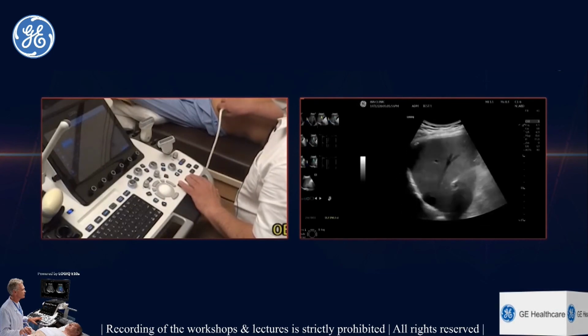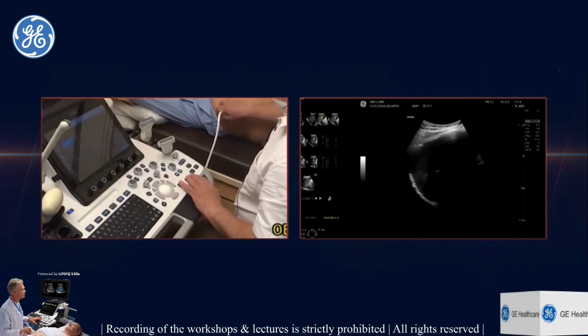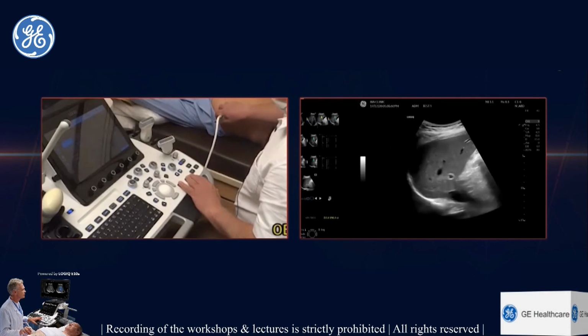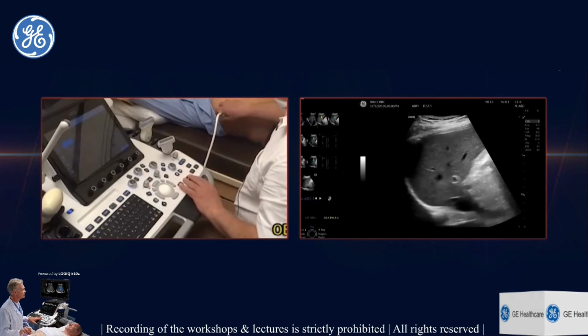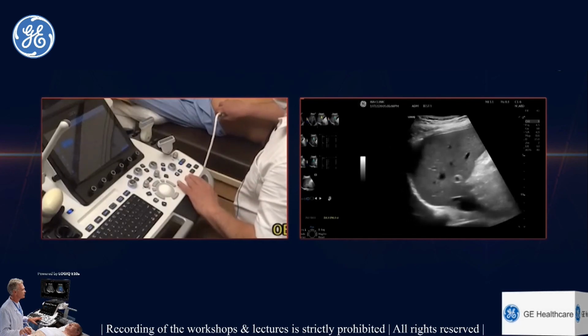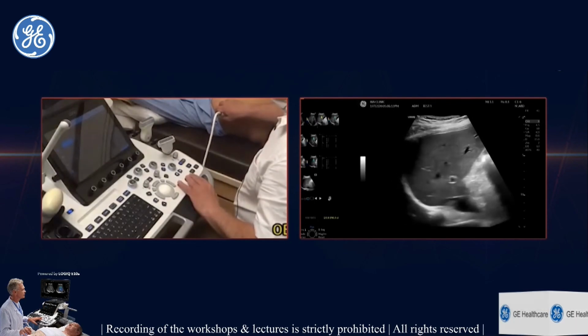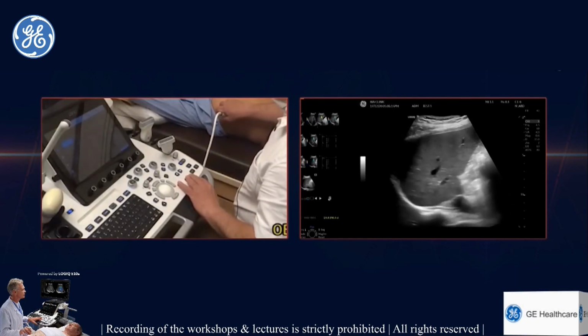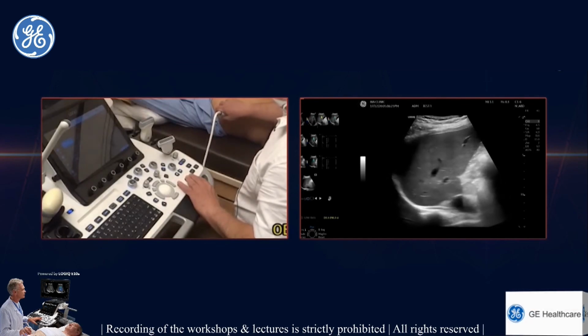The second advance that I'd like you to see is something called UGAP, that is ultrasound guided attenuation parameter. It's very important to analyze the liver fat estimation. Now, we know that NASH is a big problem, non-alcoholic steatohepatitis or non-alcoholic fatty liver disease, and there are various stages of steatosis which ultimately precede the stages of fibrosis.